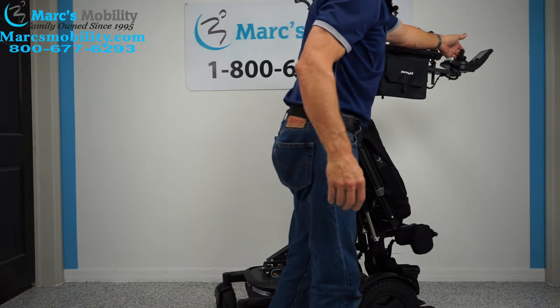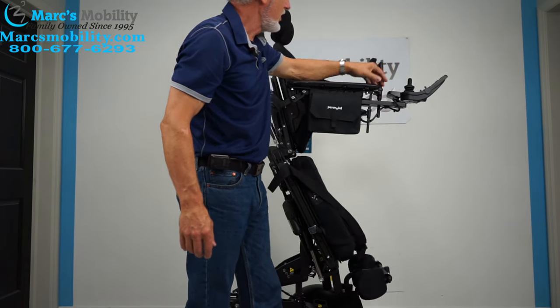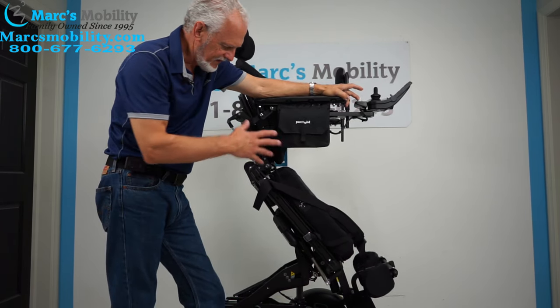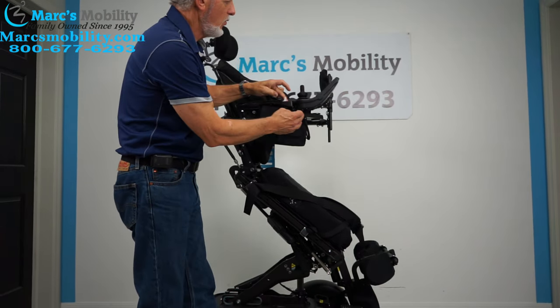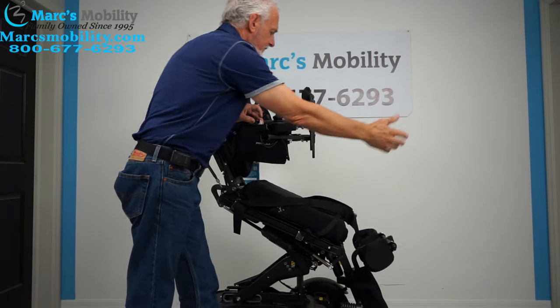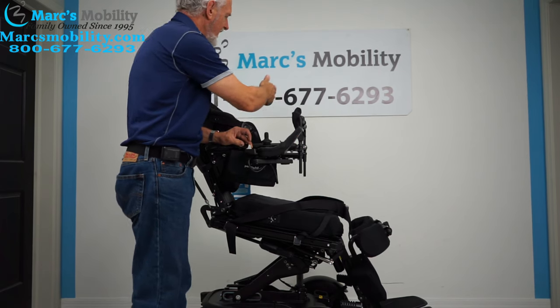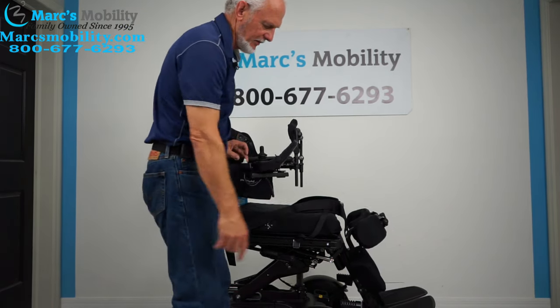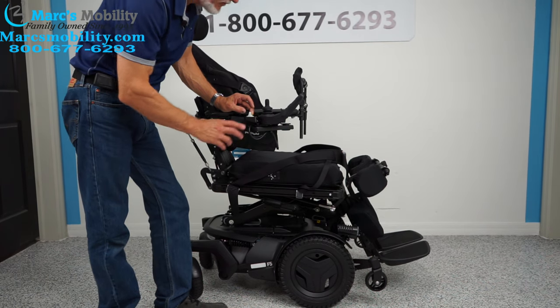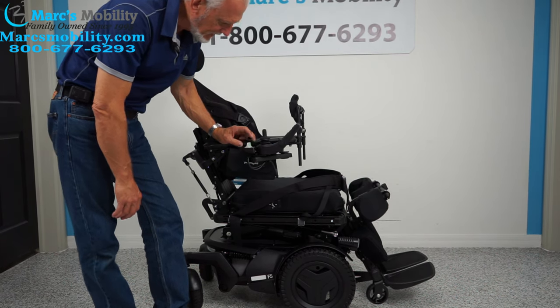Let's bring the chair back and lower the seat. As the seat comes down, let me mention the swing-away joystick — it's right here but you can move it to the side, which lets you get closer to a dining table. If you're left-handed, we can switch the joystick to the left side with no problem. This is one of the few chairs with a 14-inch seat lift — I don't know of any other chair that goes higher than that.